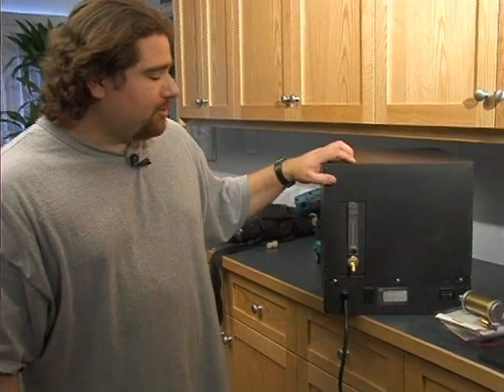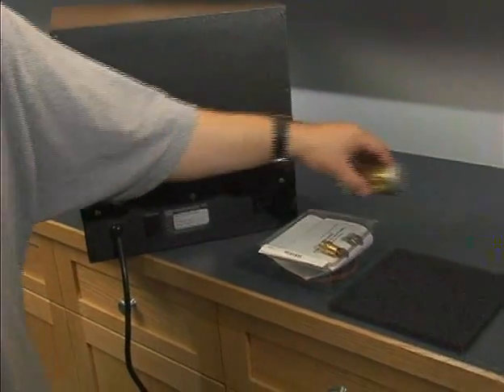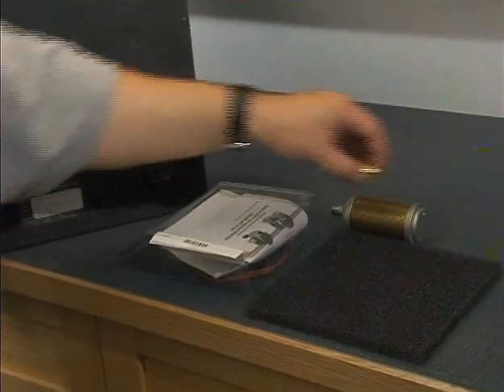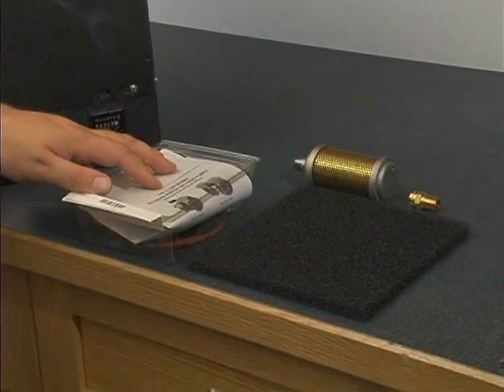Now we come to our oxygen concentrators. These do require maintenance once a year. In the annual maintenance kit we have the compressor intake filter, a pressure relief valve, the exterior filter, and the compressor rebuild kit. And we're going to go through everything.